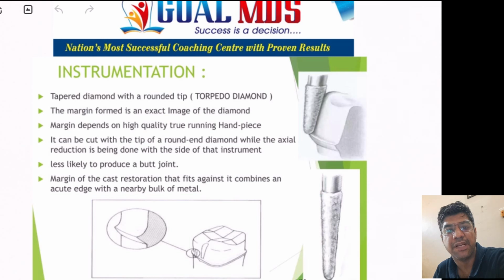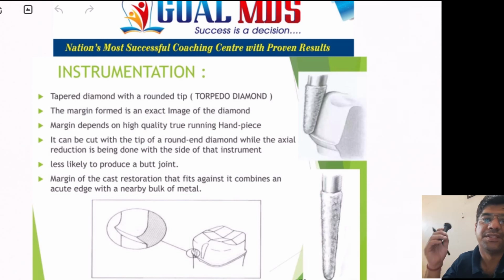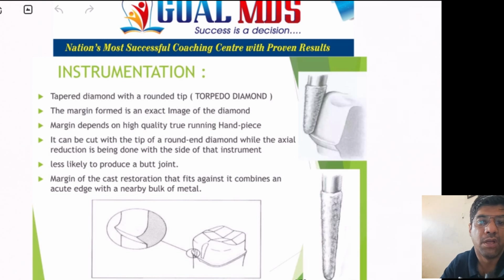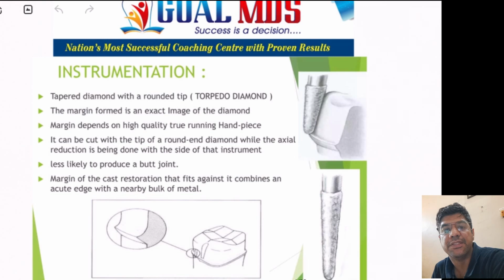Other part is the cementation. The chamfer line design provides ample space for the cementing material to flow and create a strong bond between the restoration and the prepared tooth. The chamfer finish line works particularly well for the lingual margin of the metal ceramic restoration, which results in a harmonious blend between the aesthetics and the strength. The chamfer line is gentler on the gum tissue compared to the other margins, so reducing the chances of irritation and inflammation. So it is important and crucial for the lingual margins where gum health preservation is important for both the comfort and the aesthetics.